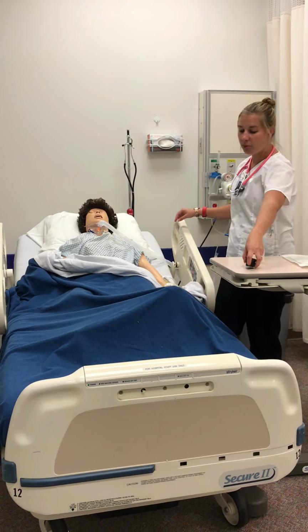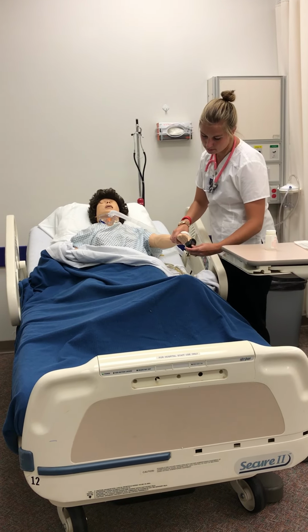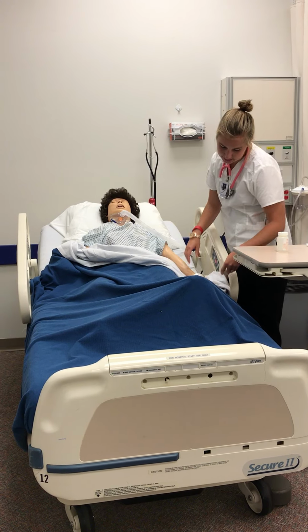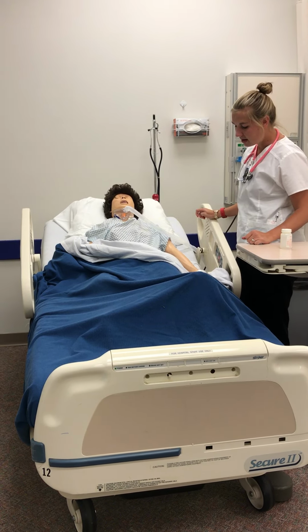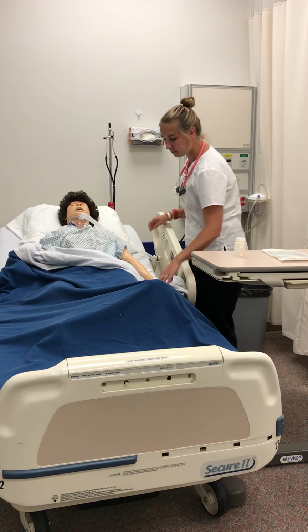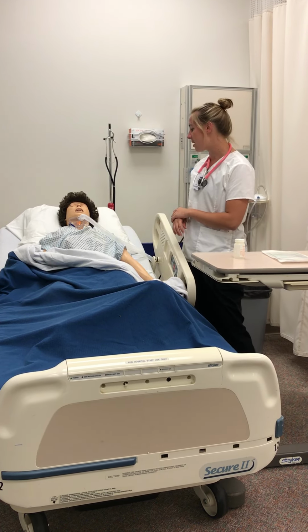So now I'm going to take her pulse ox. Which is also low. It's at 94, where we typically like to see that between 98 to 100. I'm going to leave the pulse ox on the whole time.